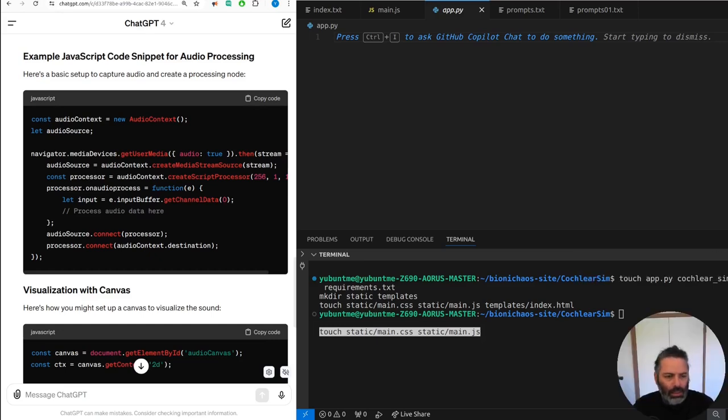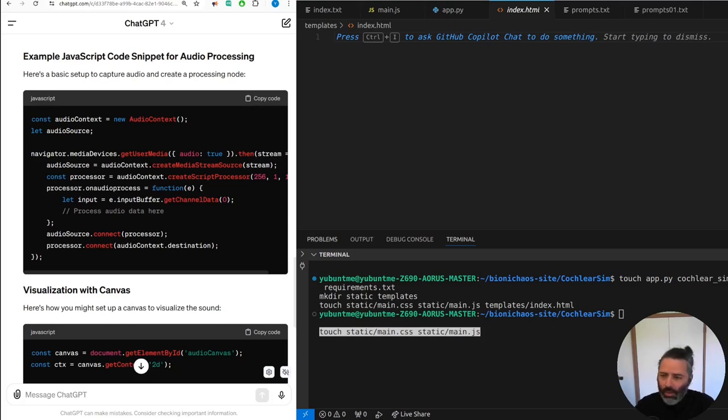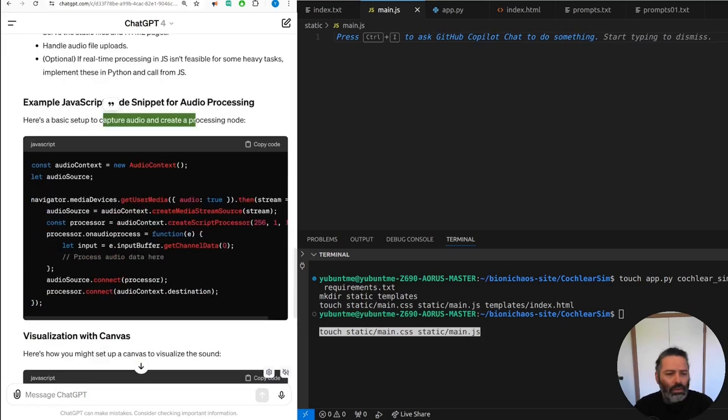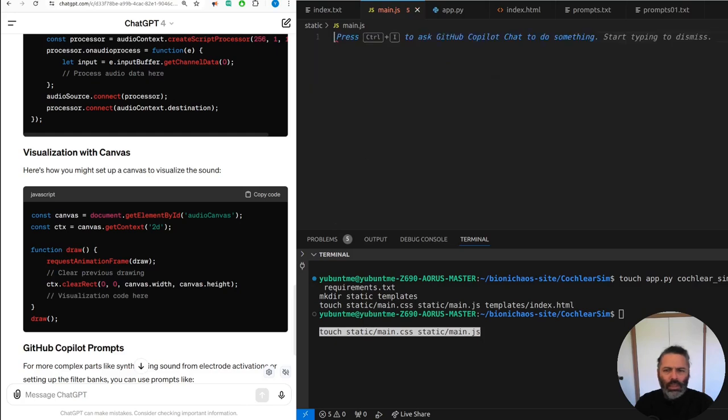Yeah, just asking GitHub Copilot to generate a template, generating a template for index.html, and then we go to the JavaScript code, main.js, that's correct. We'll ask GitHub Copilot, but then we have something from GPT-4 as well. That's suggesting a new page. We don't want a new page. Yeah, that's just weird. No, I was regenerating the HTML code.